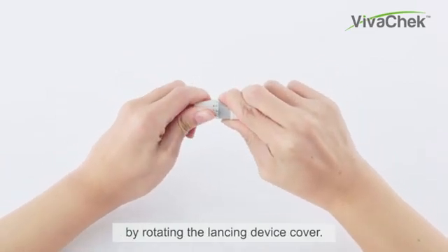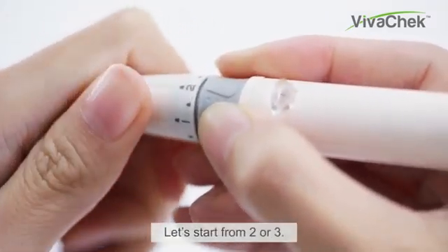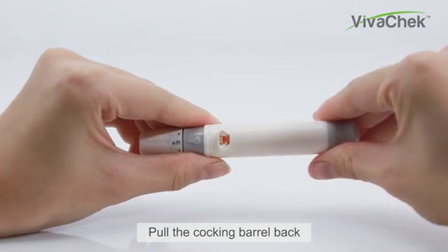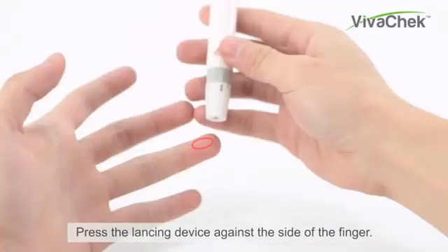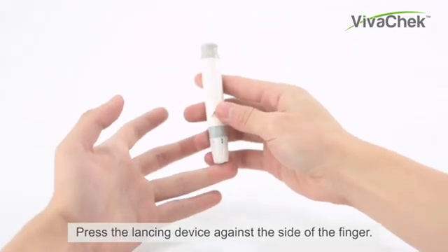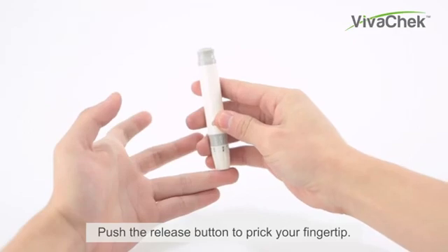The puncture depth can be set by rotating the lancing device cover, starting from 2 or 3. Pull the cocking barrel back until the release button changes to orange color. Press the lancing device against the side of the finger and press the release button to prick your fingertip.